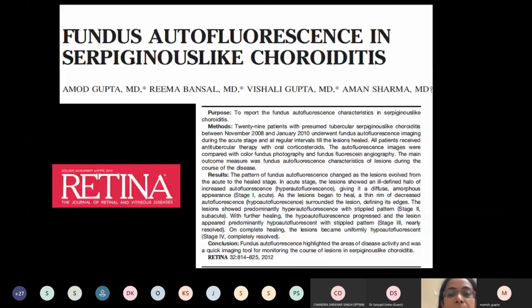Next slide, please. So we have our experience in the grading of autofluorescence images in serpiginous like choroiditis. I'll not go into the details, but this is how we stage them. Next slide, please.